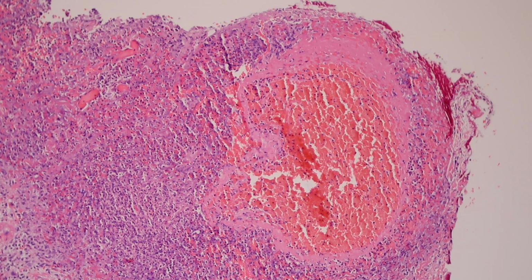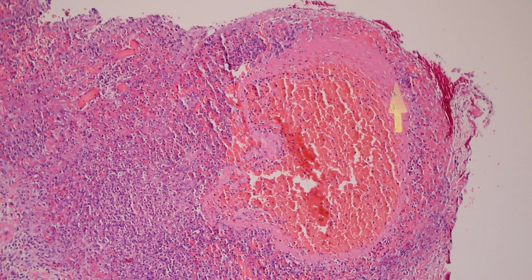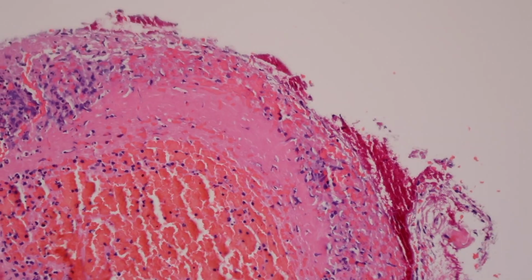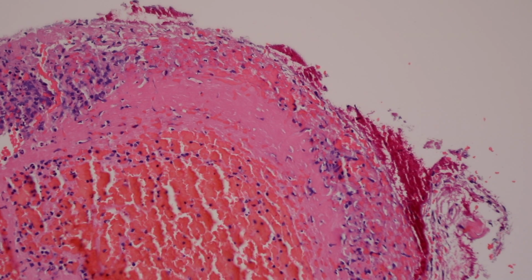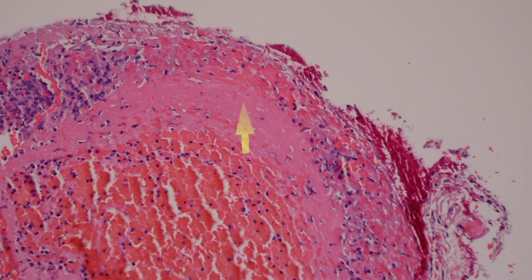So this was a vessel, and it's got blood and a bunch of fibrin. Here's the fibrin, this is the blood. You can tell the difference. Fibrin and blood sometimes are hard to tell apart, but usually you can tell because fibrin is a lot more pink than blood. So the fibrin here at the top is much more pink and smudgy looking and kind of smooth and homogeneous. And the blood is a brighter red color.